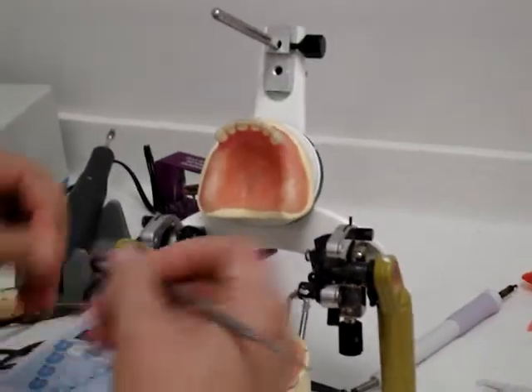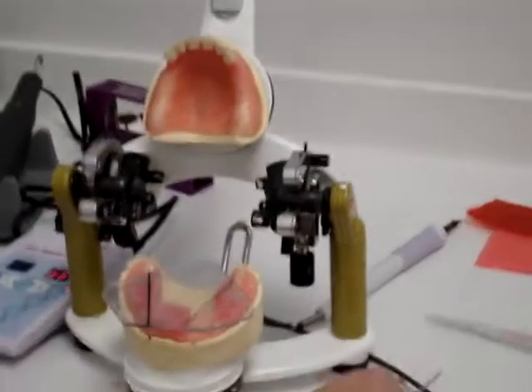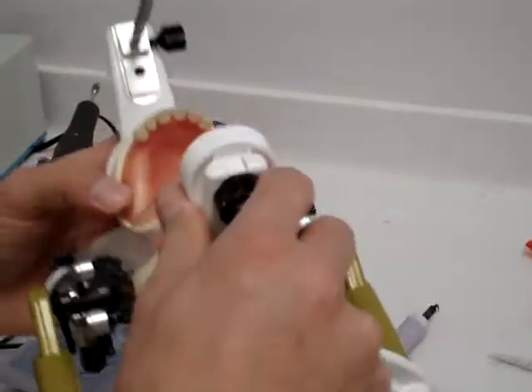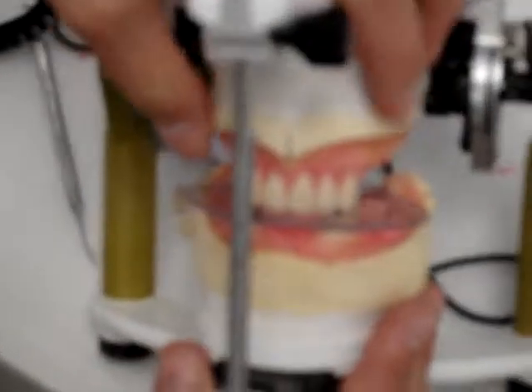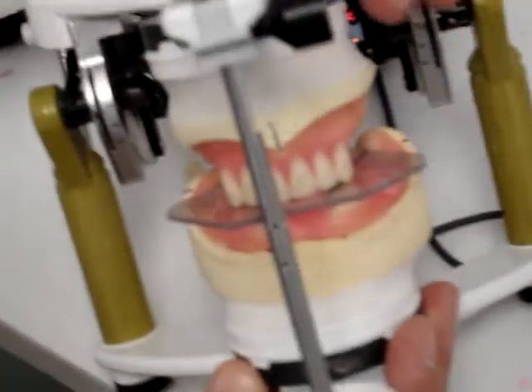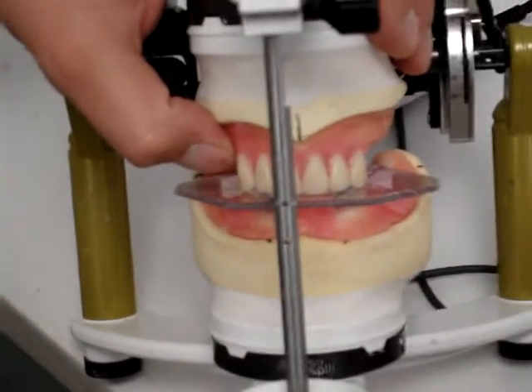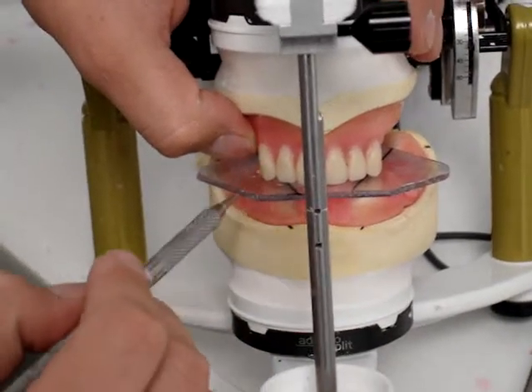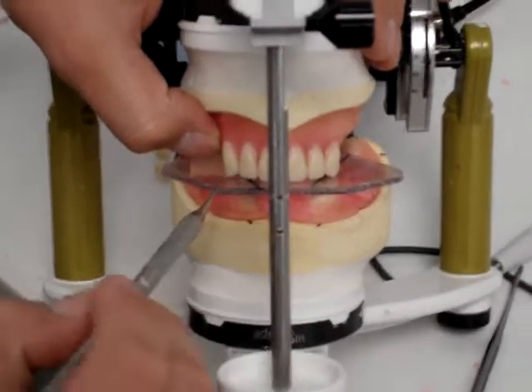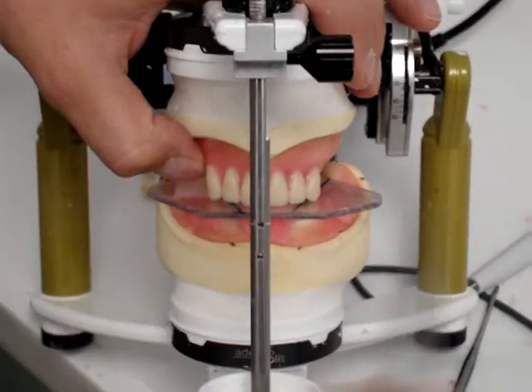Now we've got the canine set. As far as the angulation is concerned, make sure you always look at your PowerPoint, but basically they should have a slight distal tilt. It's not super critical because you're going to be moving them out of occlusion later anyway. Before you move on to the posteriors, make sure your two centrals are touching the occlusal plane, the tips of your canines are touching the occlusal plane, and your laterals are parallel with the occlusal plane, about half a millimeter above.